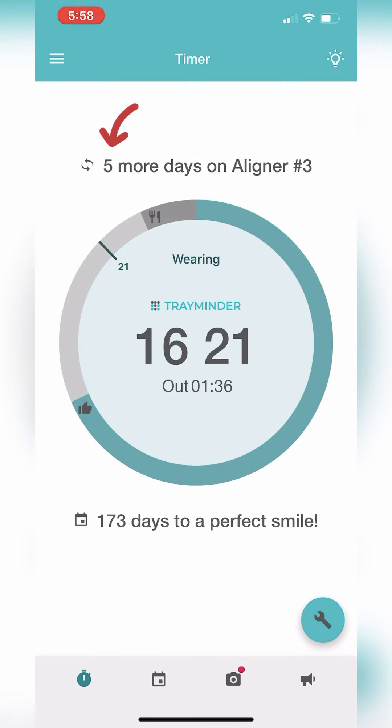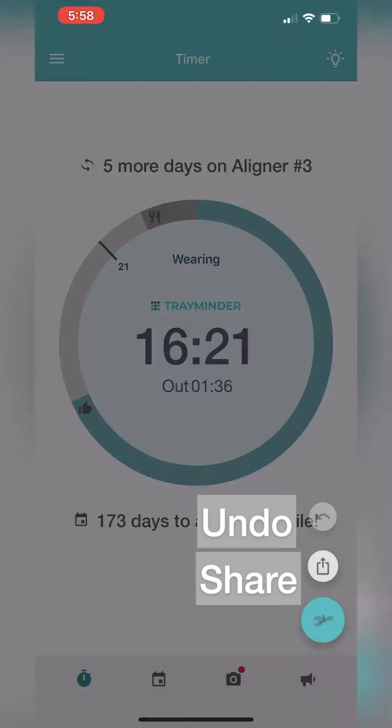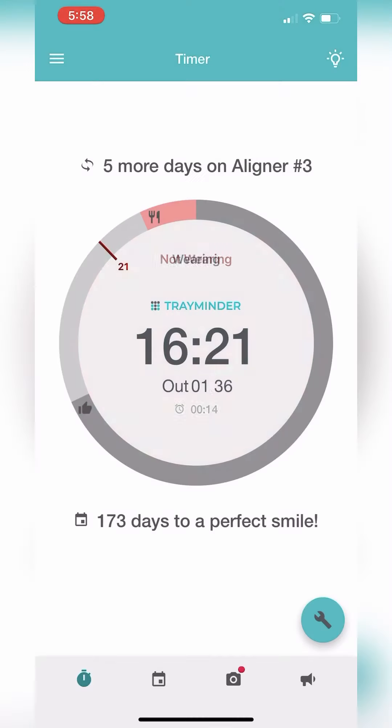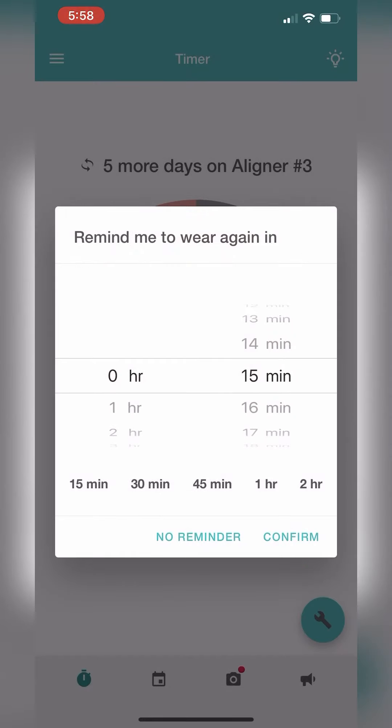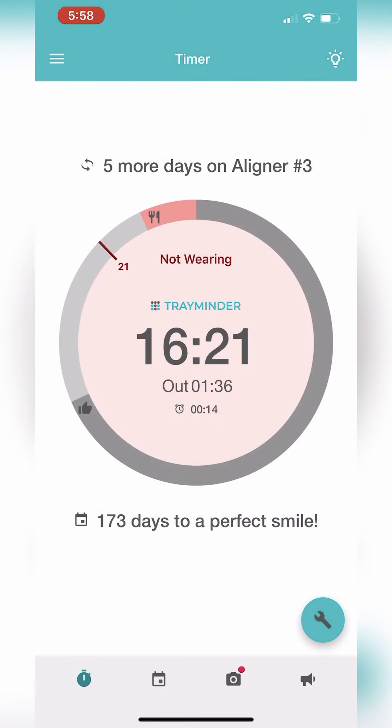The top number shows you how many more days you have on your particular tray. The bottom number tells you how many more days you have left on your treatment. There's a tool button on the lower right-hand corner that gives you the option to undo if you accidentally pause or start the timer. You can also adjust your reminder time and share a picture of your timer page.